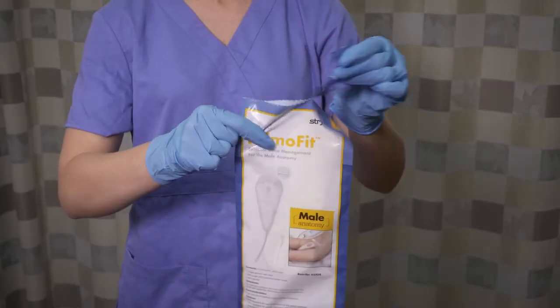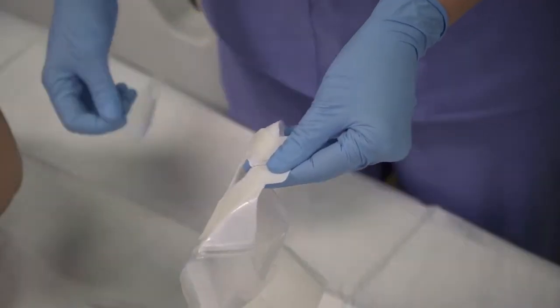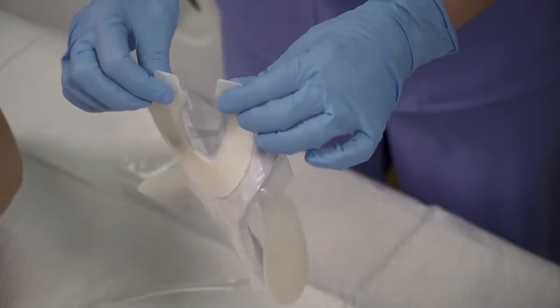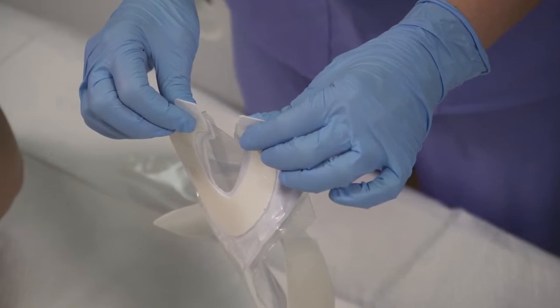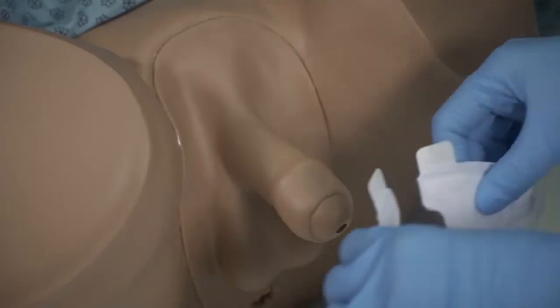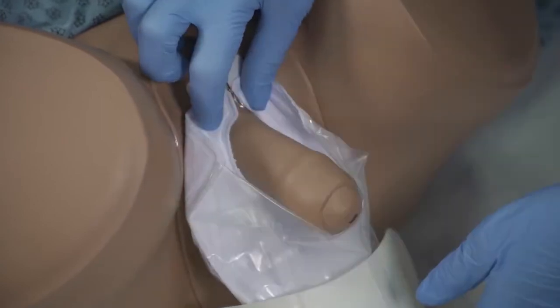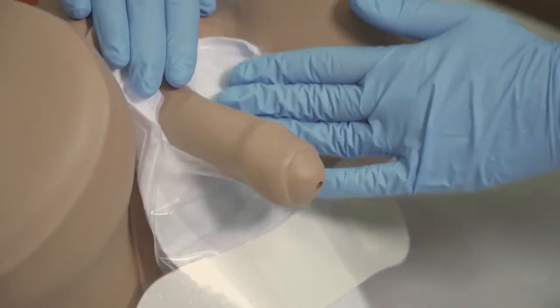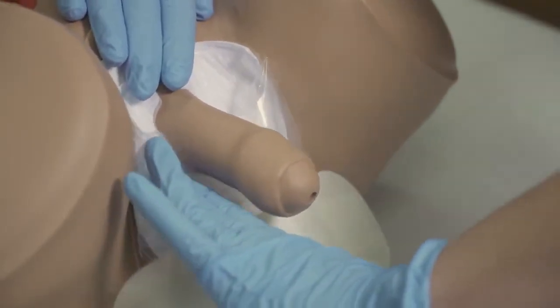Remove the device from the packaging and remove the base adhesive liner. Position the device with the adhesive side toward the patient, with the tabs facing upward and the opening of the base adhesive in line with the patient's penis. Holding the tabs, position the base adhesive up and around the patient's penis against the skin. Apply pressure all the way around the base adhesive to ensure adequate adhesion.